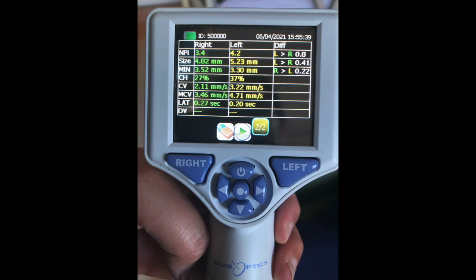Lastly, DV, or dilation velocity, which is the average pupillary speed when, after having reached peak constriction, the pupil tends to recover and dilate back to resting size. The range is measured in millimeters per second as well, and is also 0.0 to 6.0. Now, be sure to accurately chart these results in Epic under the pupillometer section to continue to trend the results from this test.